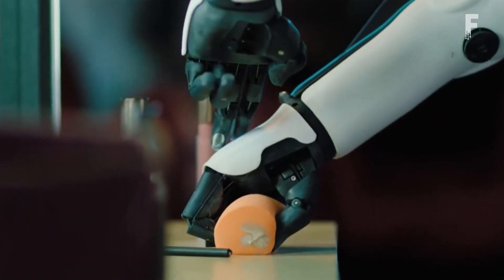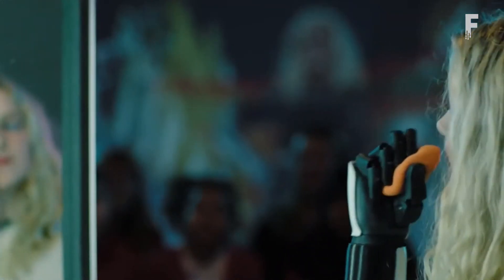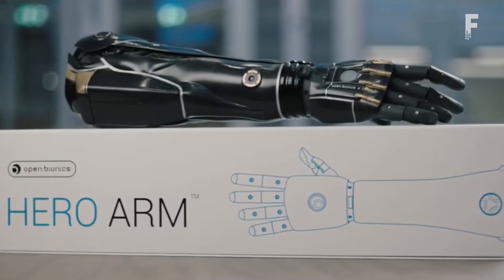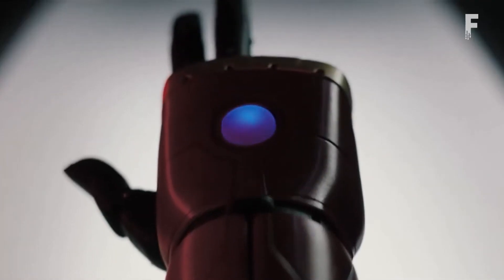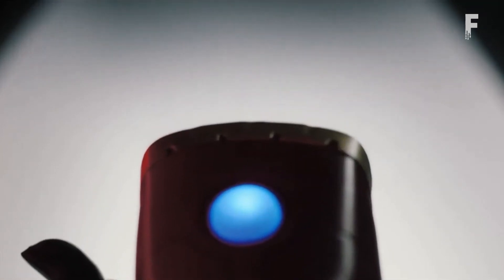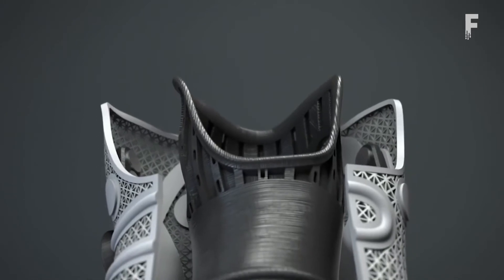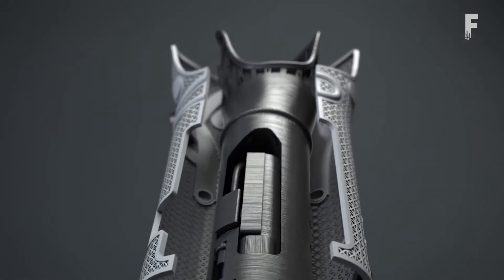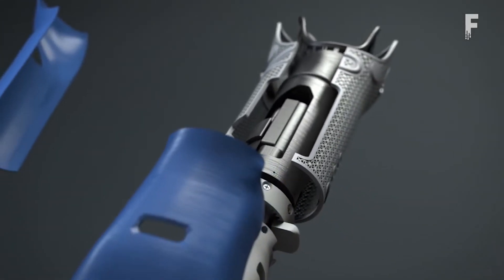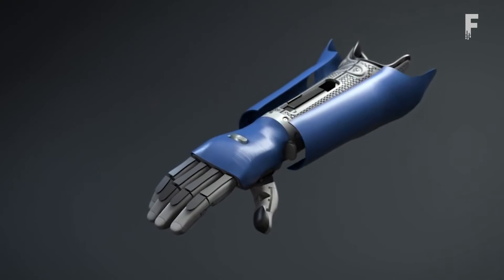It weighs under 2.2 pounds, yet can lift over 17. It's available in multiple models and sizes to suit both adults and children, and has swappable covers that can be switched out based on mood, activity, or even outfit. It's equipped with haptic vibrations, beepers, buttons, and lights for notifications, along with special sensors that detect muscle movements, which means the user can effortlessly control the bionic hand with intuitive, lifelike precision.